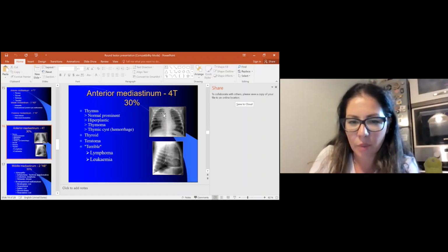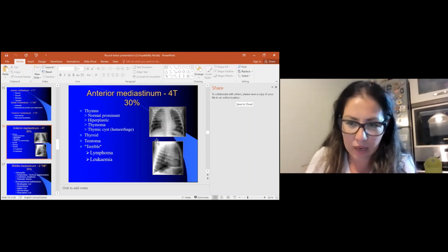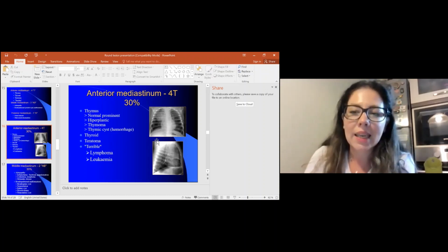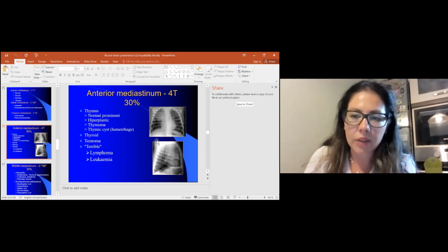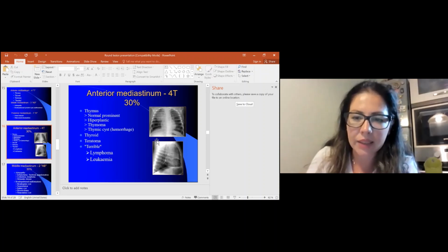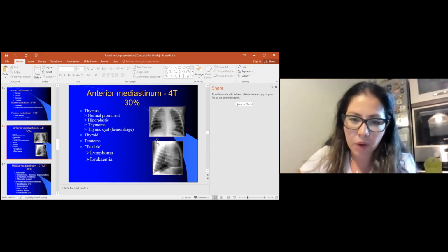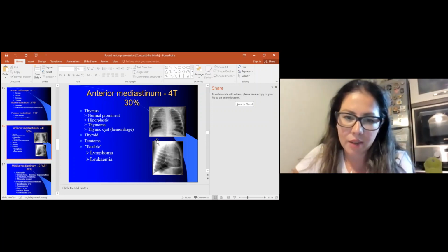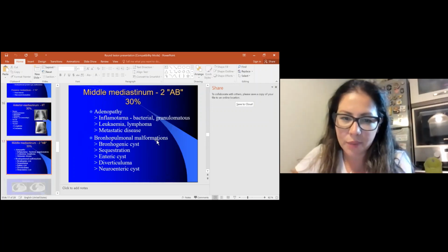So this is very pathognomonic and very often unexperienced or young radiologists can mix it with masses and continue with CT or MRI, which is of course unnecessary for children. That's why it's also a very big challenge for diagnosis.